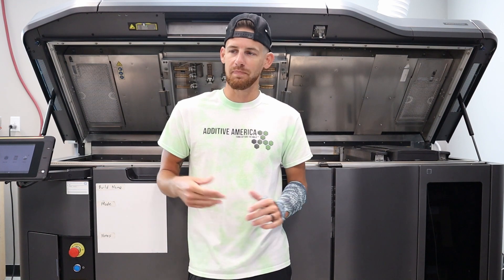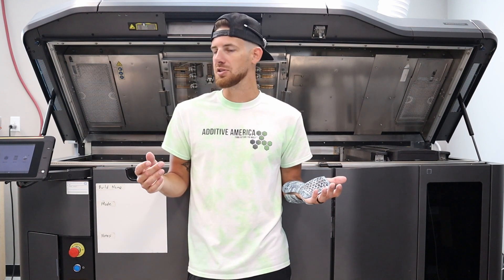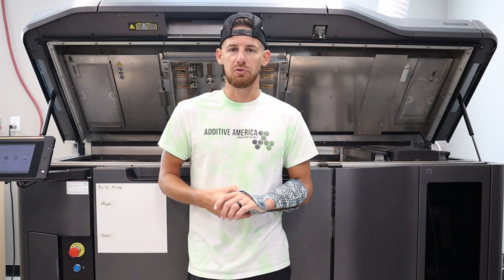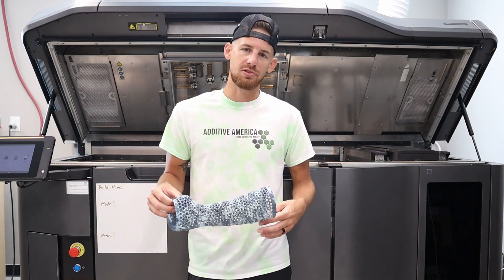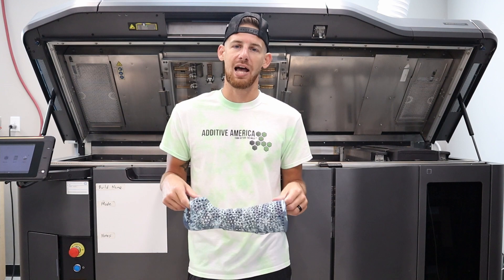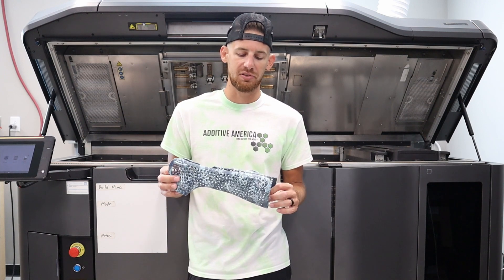Brent went ahead and got the scan done really well, got the file to us pretty much the next morning after the incident, and we were able to print it on the machine that day, have it out the next morning, and then run the thing through the treatment during the day. The part is ready to go in about 24 to 30 hours after we get the file.